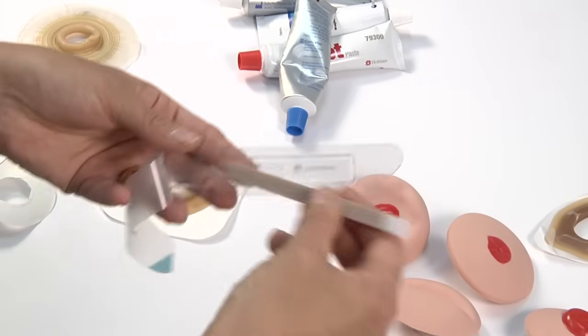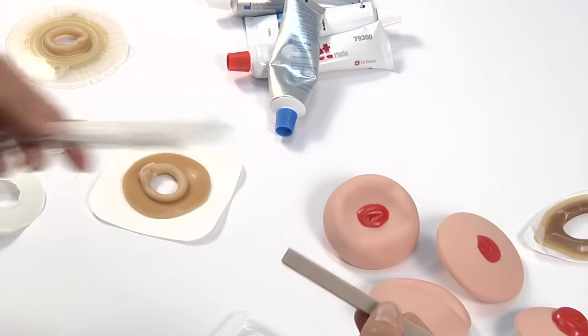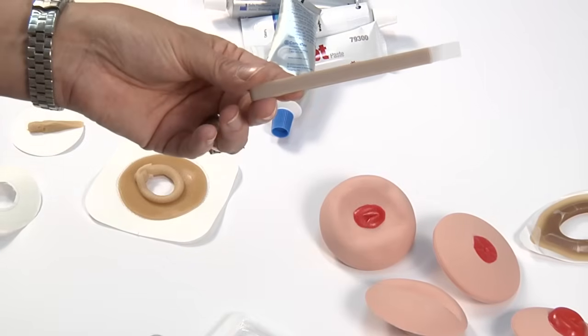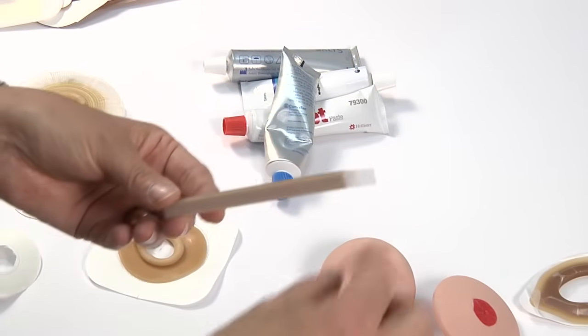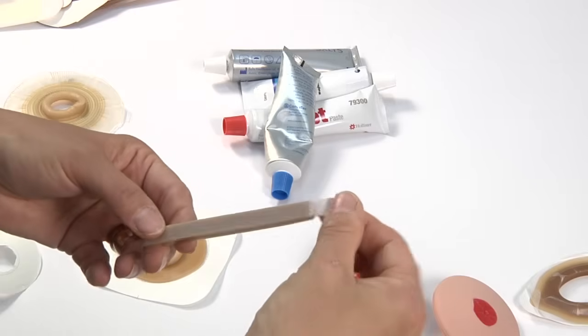I don't actually have an example of it here, but it has an awful lot of what we call memory to it, meaning that when you distort it or you play with it, it actually wants to go back into the shape that it originally started out being. This one from Coloplast is a little bit different.